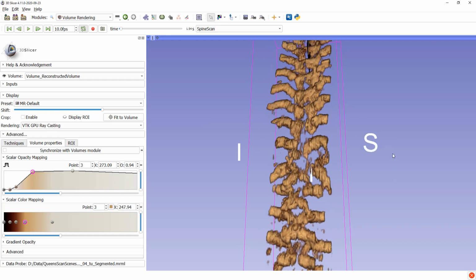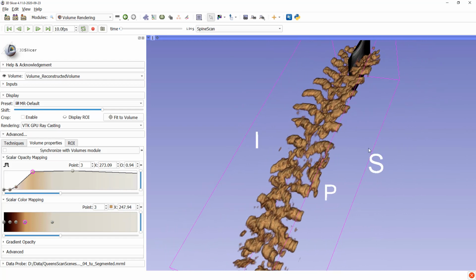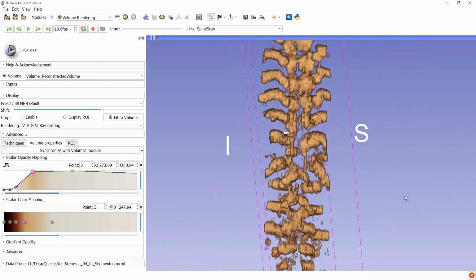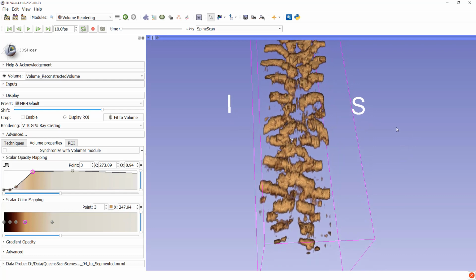In this particular application, we measure spine curvatures by using standard markups available in 3D Slicer for angle measurement. But you can see the reconstructed posterior surface of the entire spine.